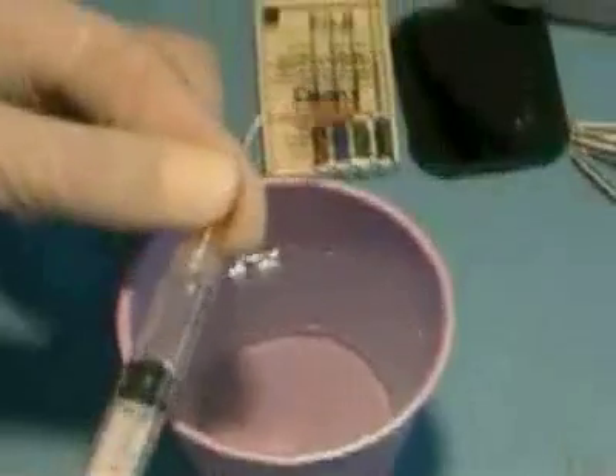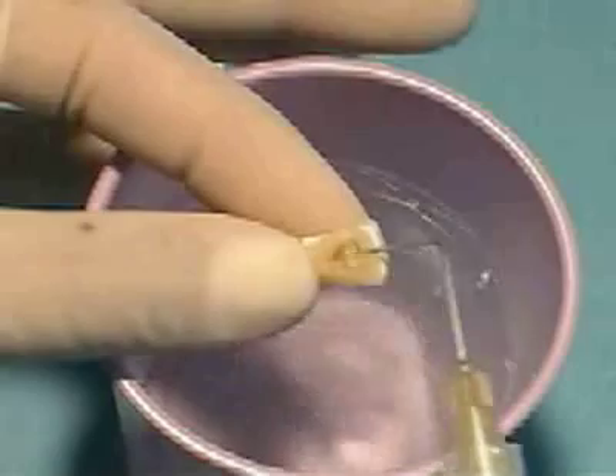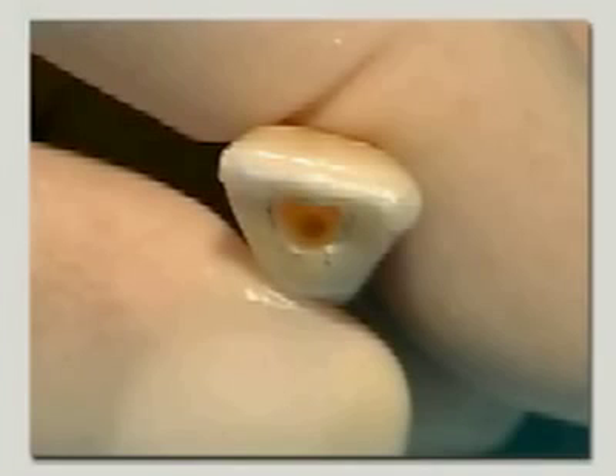Using this needle, gently flush fillings and debris from the chamber. The needle should fit the canal very loosely and the solution should be introduced very slowly, so that it can run back out of the access opening and is not forced through the apex. The resulting cavity should be smooth and continuous, flowing from cavity margin to canal orifice. This is referred to as straight line access.